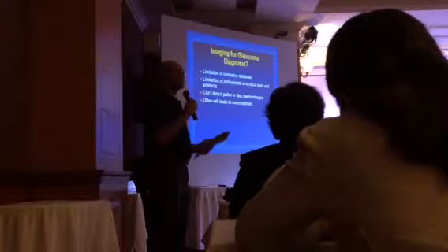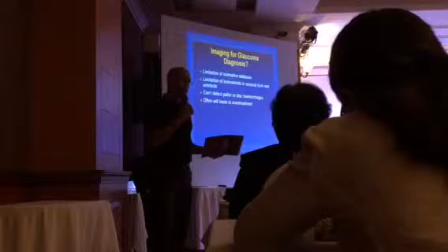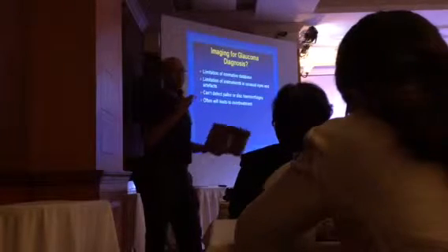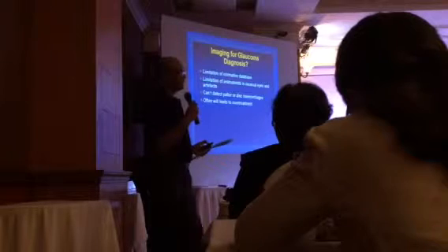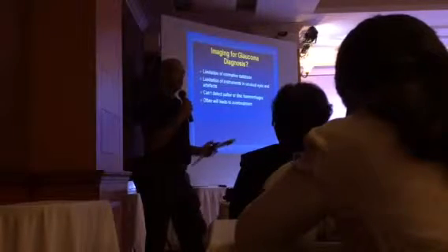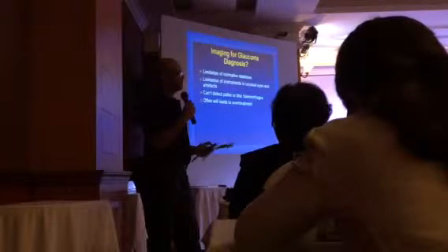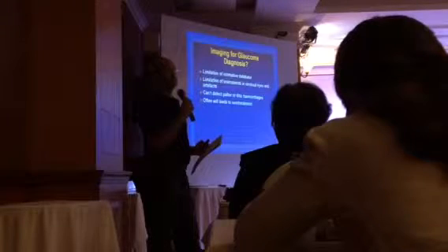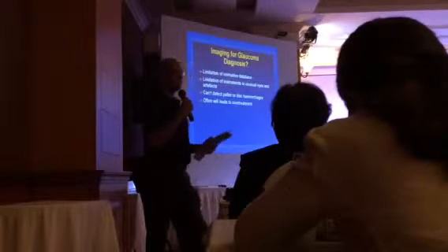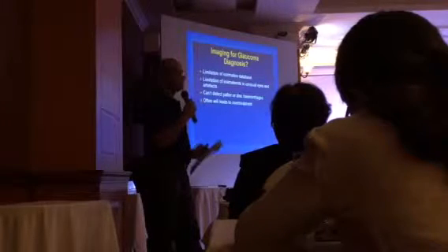The limitation of the normative database: as you probably know, the database for imaging is quite limited, and you won't be seeing patients that fit the database all the time. There's a limitation of these instruments in unusual, highly myopic eyes. There are artifacts from vitreous floaters, and artifacts from a poor view through the cornea.